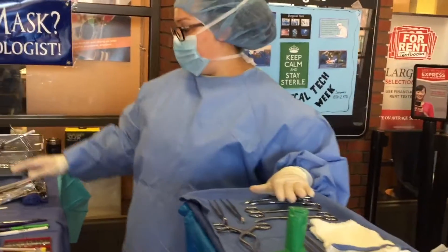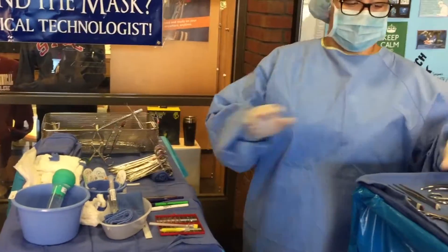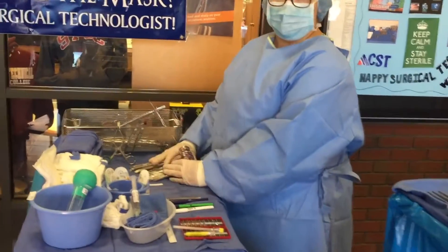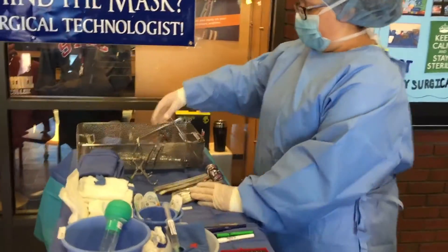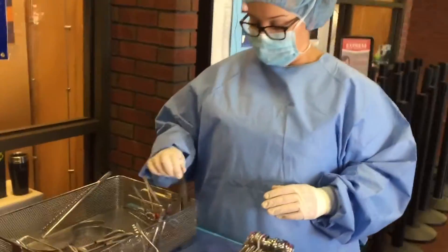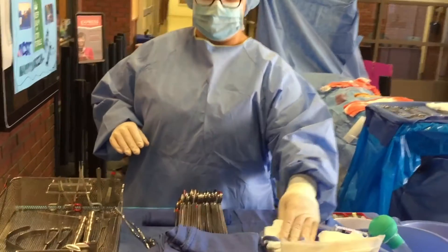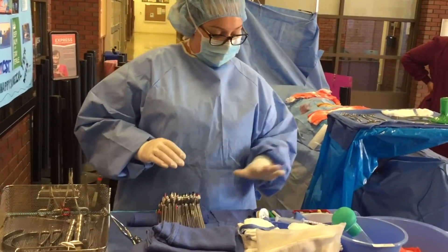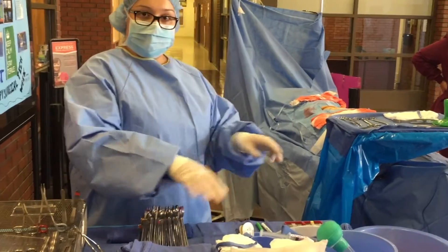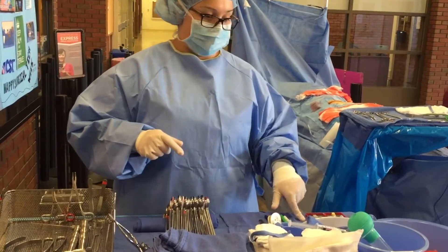Where we get our instruments from? We can go off our back table which is over here. So we can pick some things off our back table, move them to our Mayo stand. I've got all my instruments lined up easy so that I can grab — extra retractors in here, extra clips, more forceps that I can grab from. I have all my towels and sponges in case I need to get more sponges. I have all my sharps here in the corner in our safe zone. That way I'm not stabbing myself — we don't want to contaminate anything, so I keep all my sharps in one spot.